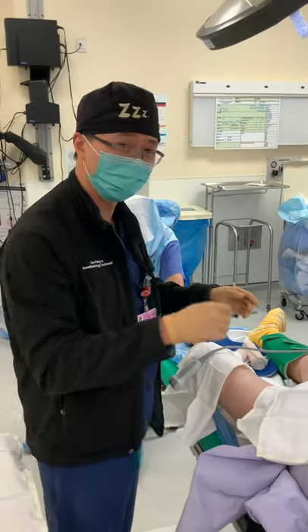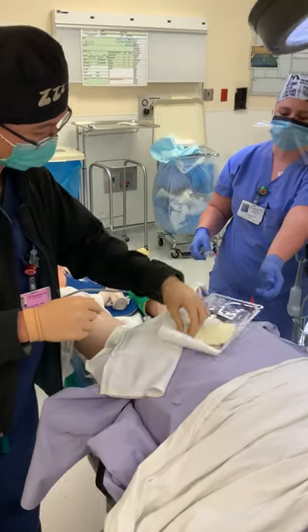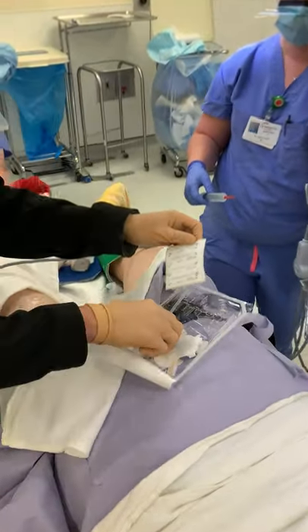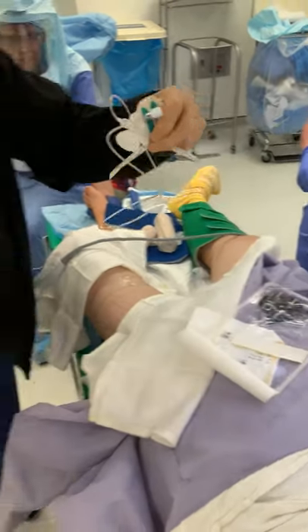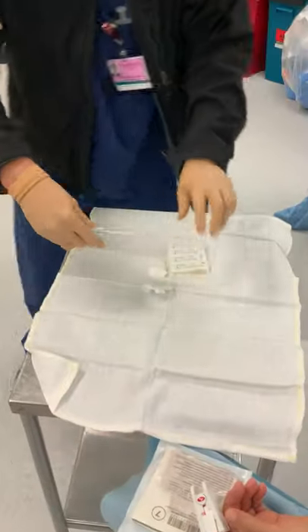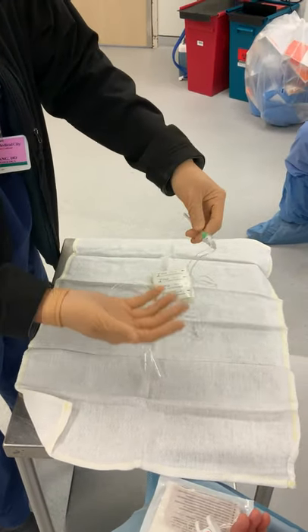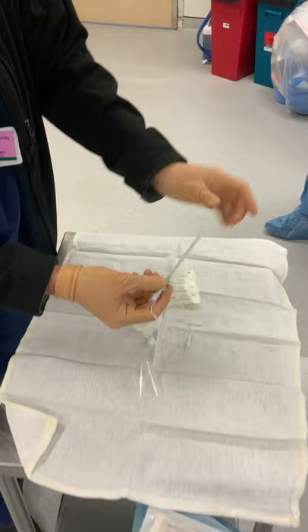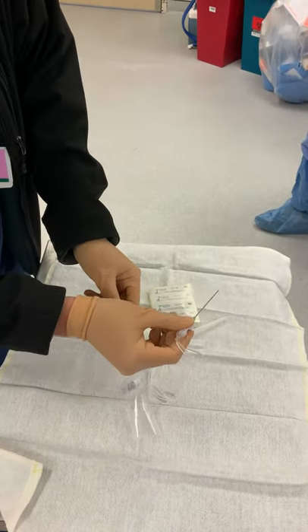It's a pretty cool system. It uses a catheter through the needle. We've already opened the kit and there are a few things in here. I'm going to lay them out on the tray. You'll see there is a green needle here, and this is the actual needle you'll be using to do the block. You can see that it comes with this little protector.